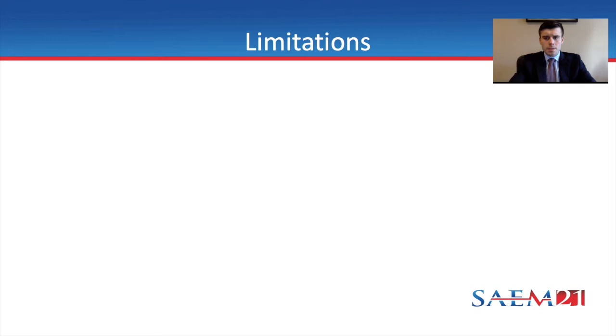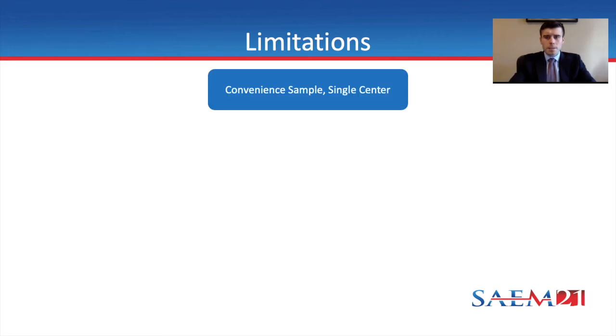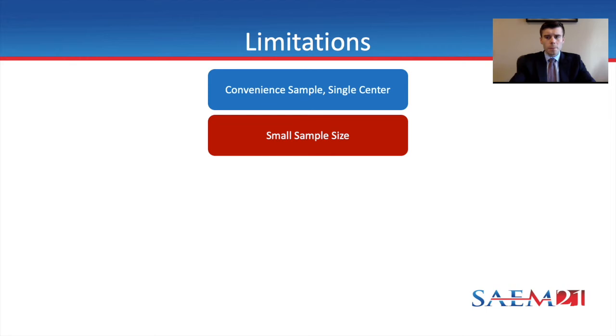As with all studies, our project has its limitations. Our study was performed in a single center, an urban academic center that serves a predominantly minority population. This may limit applicability outside of this clinical context. In addition, our small sample size of 104 patients that completed all 3 steps of the evaluation, which includes the EP ophthalmoscopy, the ocular ultrasound, and the ophthalmology evaluation, may limit the strength of our study.